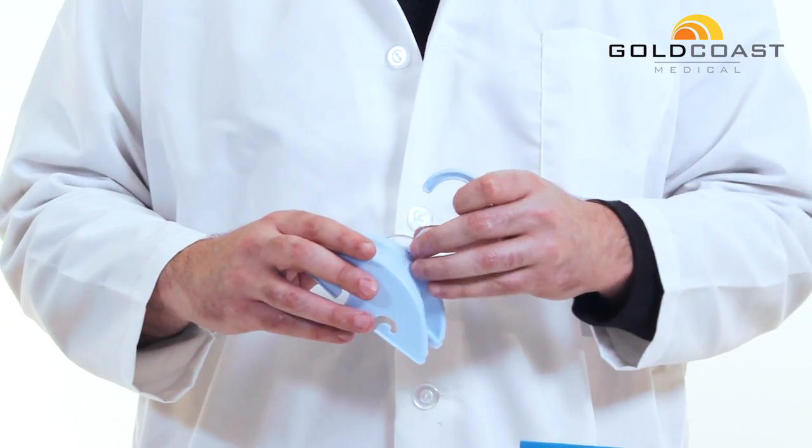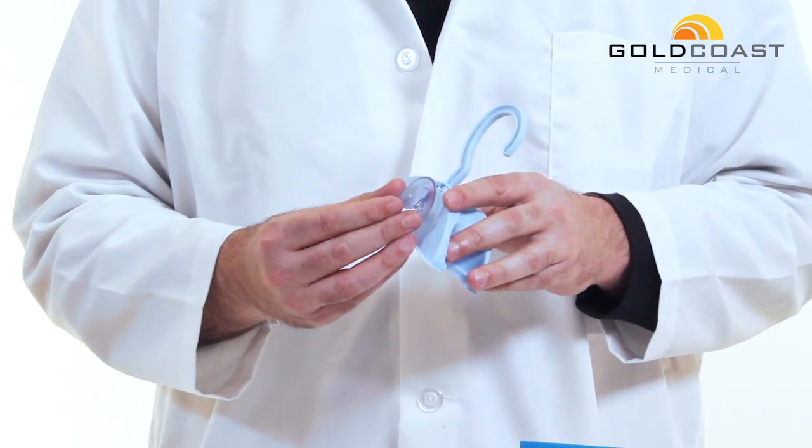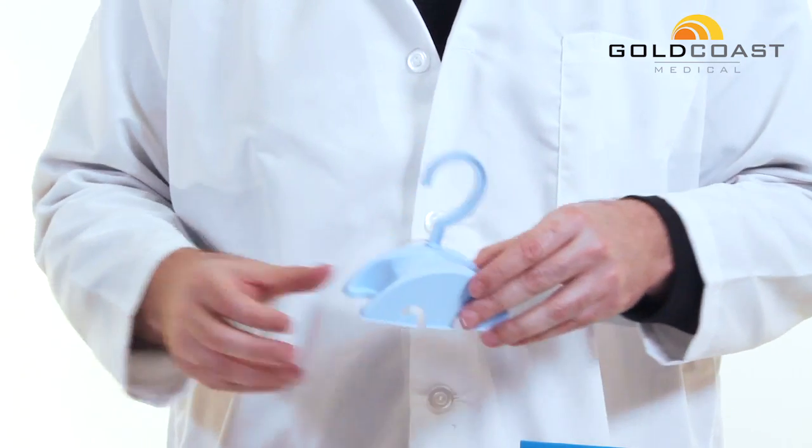You can take the hook, simply slide it into the slot here. There's also a suction cup on the back, depending on how you want to hang the hanger.